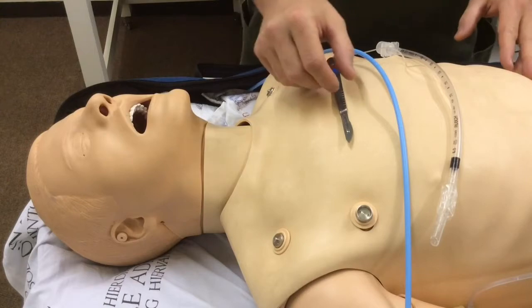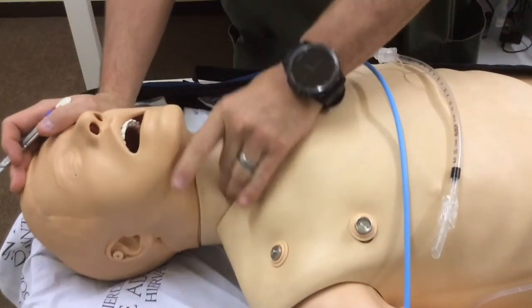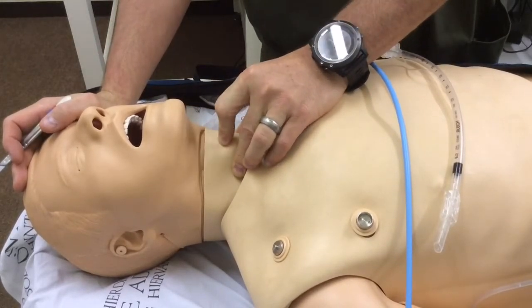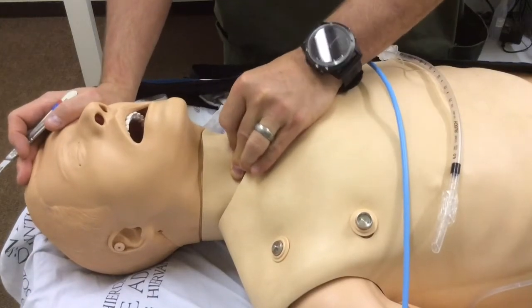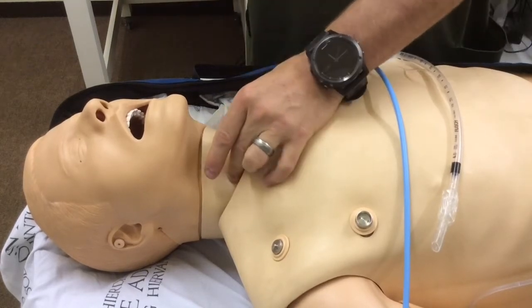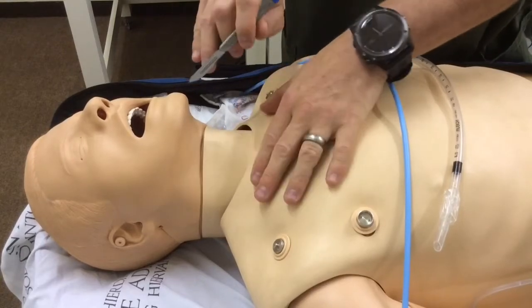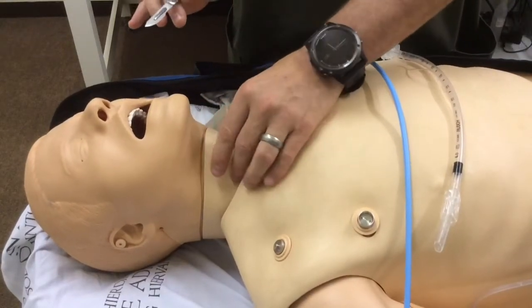To perform the technique, we are going to do the laryngeal handshake — feel the larynx and make sure that we've got the cartilages in our fingers. Feel down in the midline with my finger and identify the thyroid and cricoid cartilage and the cricothyroid membrane. If I cannot feel the cartilages clearly at this stage because of a patient with a thick, edematous, or fat neck, I'm going to make a vertical incision in the midline and blunt dissect with my fingers until I can feel the cartilages.